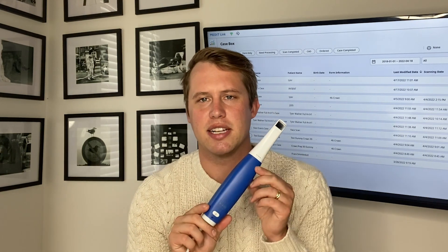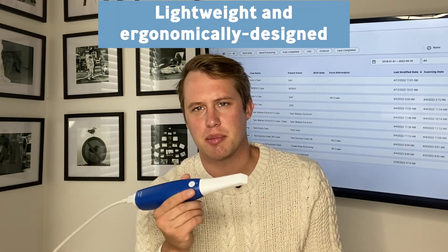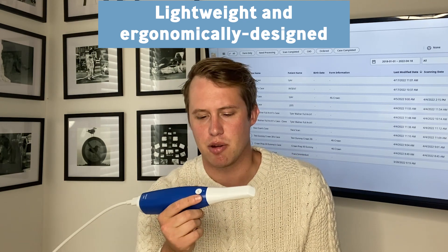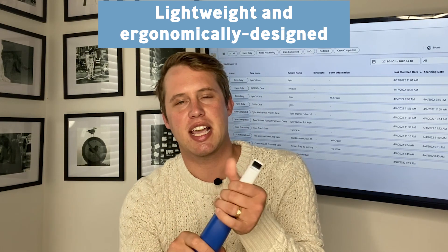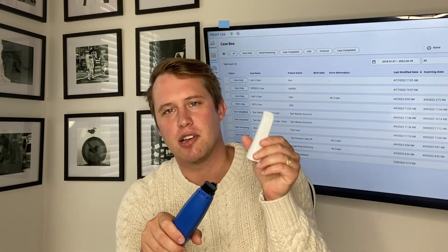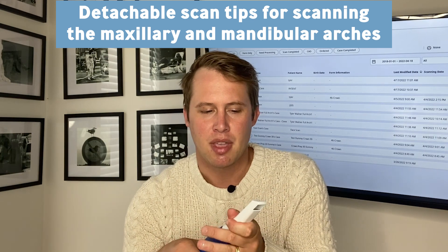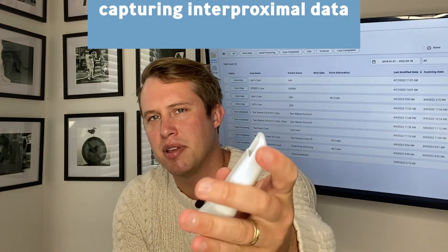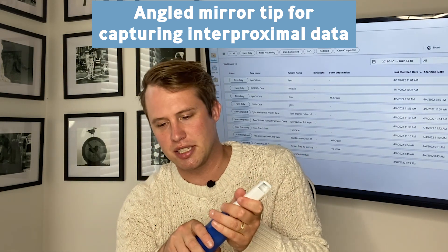What I really like about the Medit i600 scanner is how lightweight it is. It feels very ergonomically designed — it fits in my hand very well, almost like painting with a paintbrush. The scan tips are detachable, allowing you to scan the maxillary and mandibular arch very easily. The angle of the mirror on the scan tip is diagonally placed so you can capture those interproximals very easily.